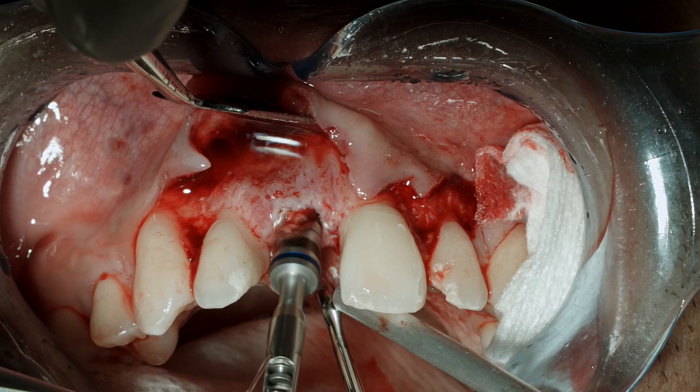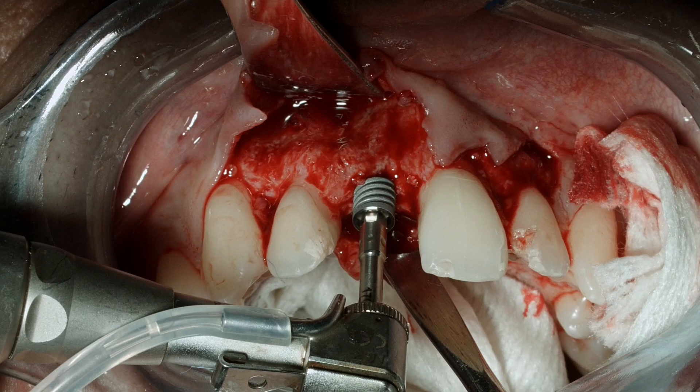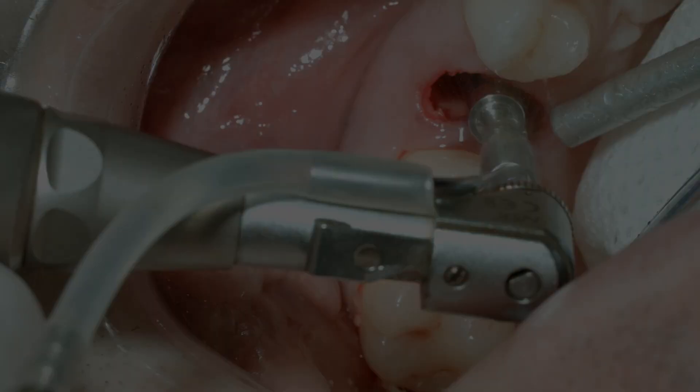The combination of the tapered implant design and the excellent self-cutting threads is going to allow for ease of placement with minimal bone compression and excellent primary stability. We can see how as the implant reaches depth it's going to lock in place very nicely into the alveolar structure — set at 45 newton centimeters. Here we can see the post-operative radiograph for the central incisor implant replacement.